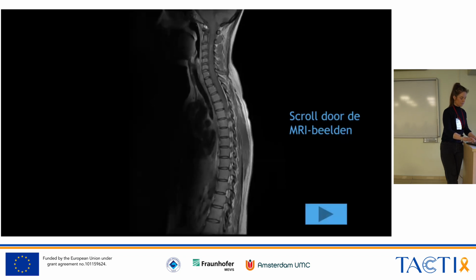How about if all the lesions you see in the brain all enhance and you have no non-enhancing lesions? Yeah, that's a good question. If you see all lesions enhancing, we had an example yesterday. Do you remember what the differential diagnosis is there, the differential?